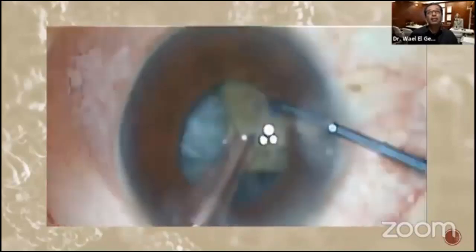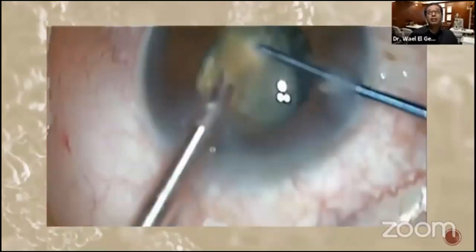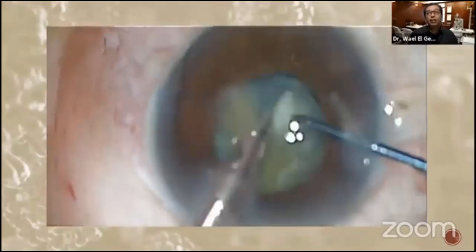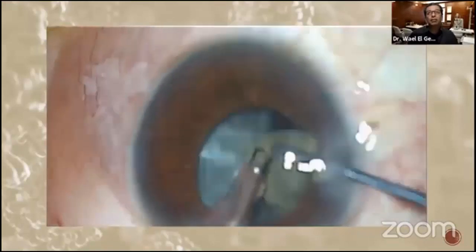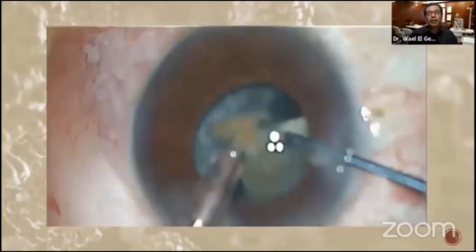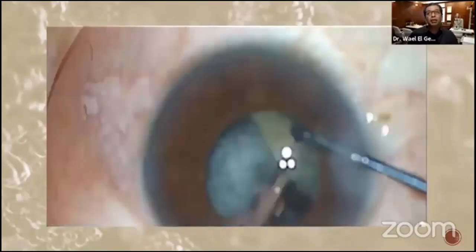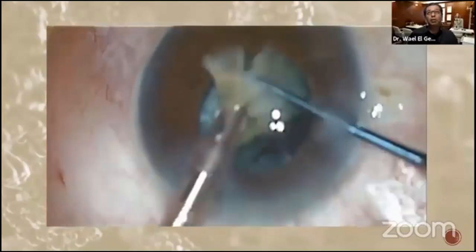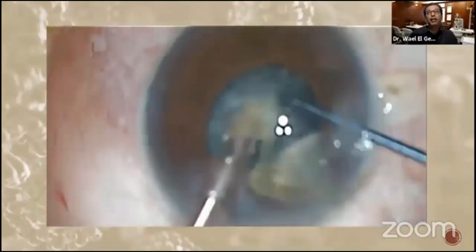Well, take it to the center because I'm getting a narrow pupil now. Take to the center and vacuum, high vacuum with bursts of Phaco or pulses of Phaco. I try to make sure that my particles are not flying around in the anterior chamber or the posterior chamber or in the bag.